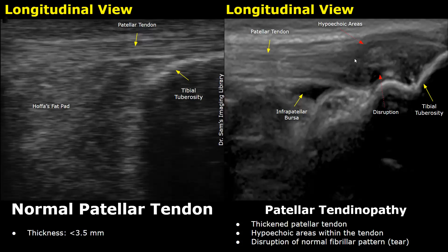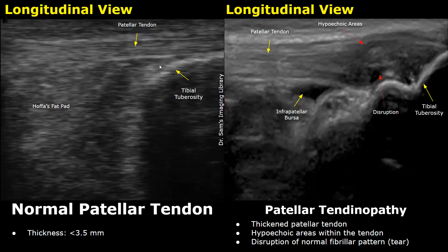This fluid-filled structure is the infrapatellar bursa. The normal bursa is hard to see on ultrasound — usually it is invisible — but in this case there is inflammation, so there is fluid accumulation in the bursa as well.